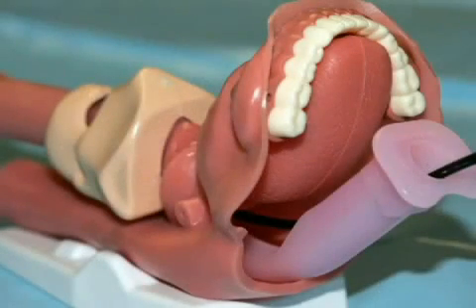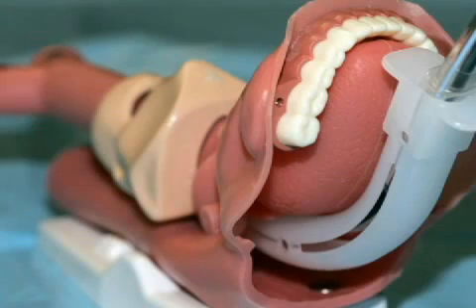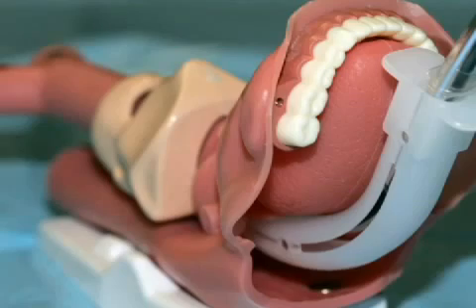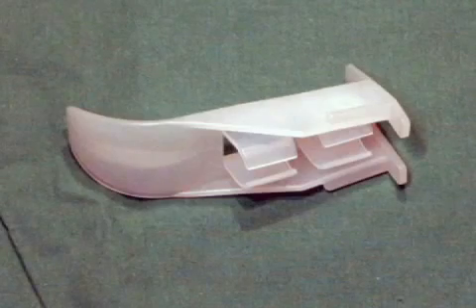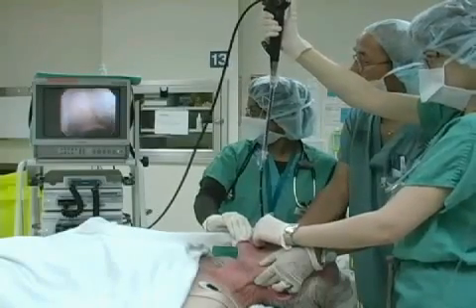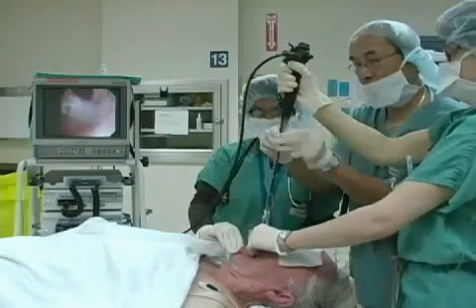Various oral intubating airways can also be used during fiber-optic intubation. These may help to keep the bronchoscope in the midline and align it with the glottic opening, displace the tongue anteriorly and the soft palate superiorly, thus opening the pharyngeal space, and to protect the scope from bite damage. These include the Berman intubating pharyngeal airway, the Williams airway intubator, and the Ovassapian fiber-optic intubating airway. While these airway intubators may be helpful, the emphasis should be on the development of skill with bronchoscopic manipulation, positioning, and regional anesthesia of the airway.